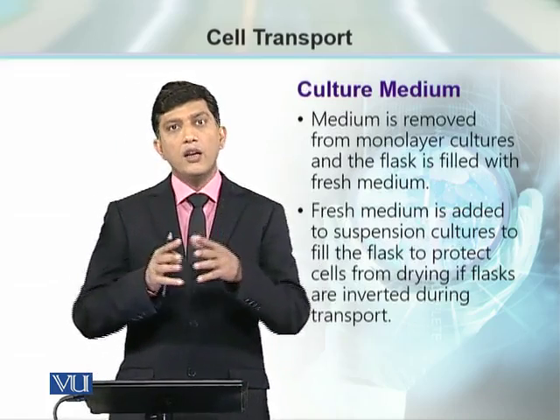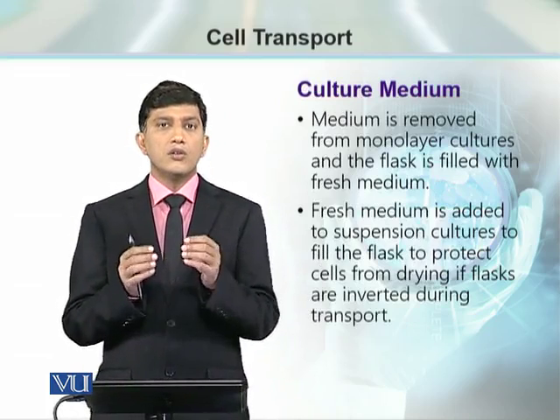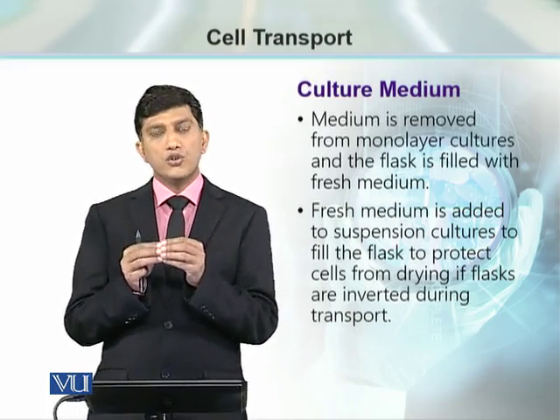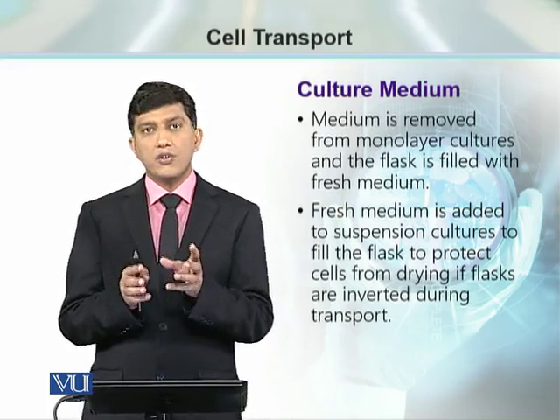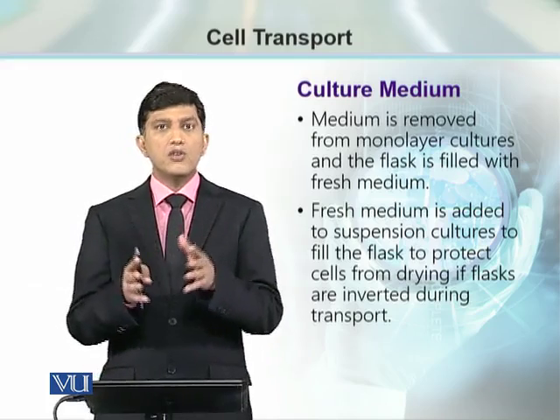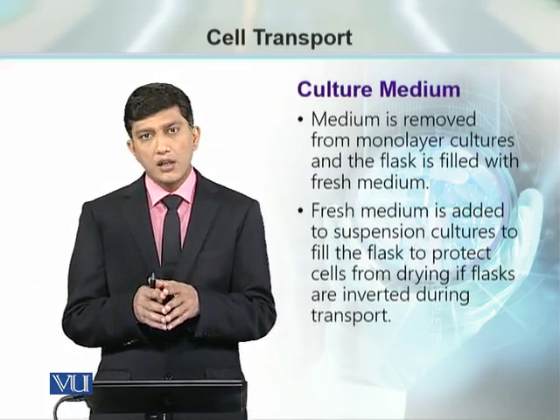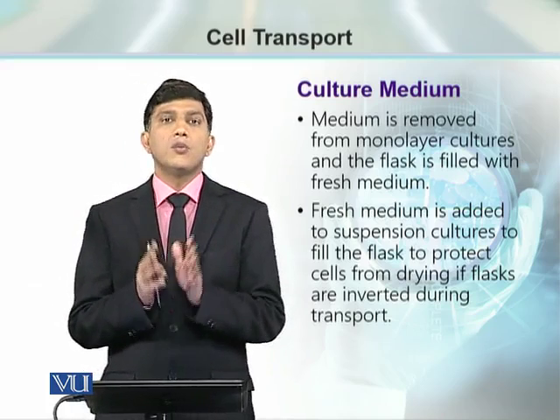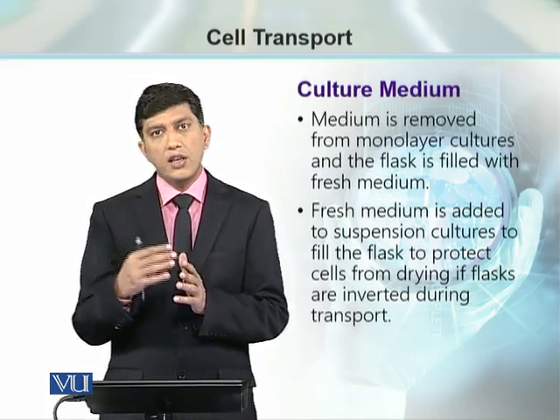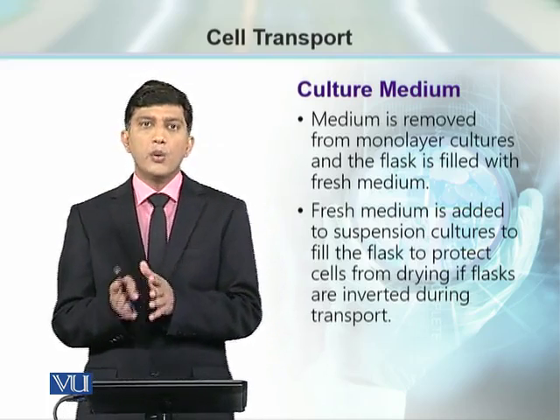Once the required culture condition is achieved, then we need to ensure that during the transportation period the culture medium should be sufficiently rich in nutrients. It should not be exhausting. Its pH should be near normal, which is required for the cell culture. For that purpose we ensure that once the culture is at the required density level, we replace the previous or older culture medium with the fresh culture medium.